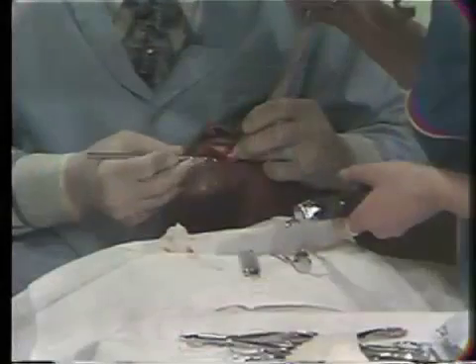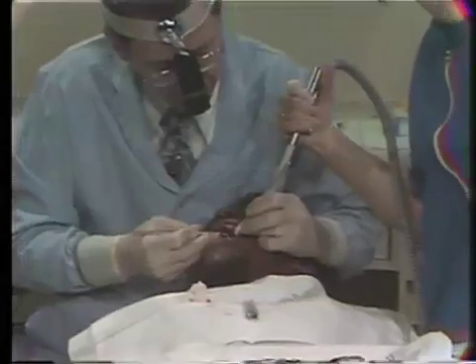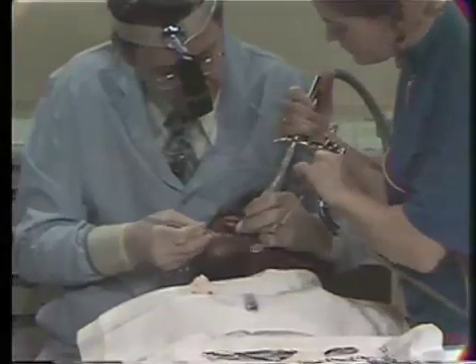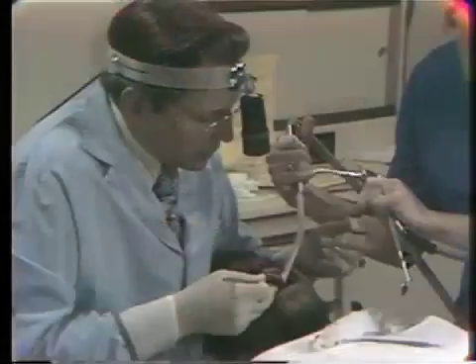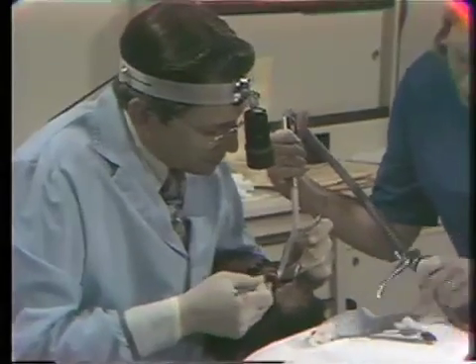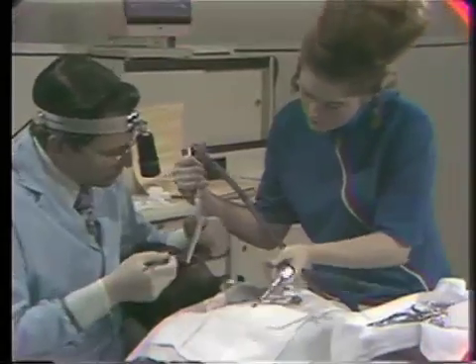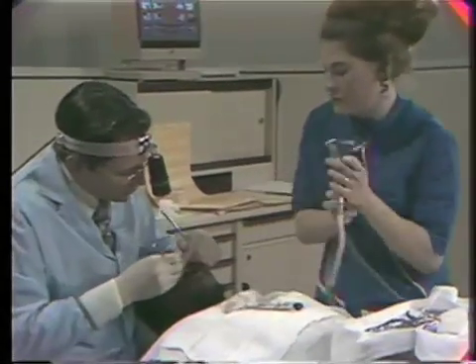If you notice, this headlight that I'm wearing is very helpful during this type of activity too, because both the assistant and myself get in the way at times. Now notice how Betty keeps those mirrors coming in there. Not the other button. Okay, lingual, number 9.